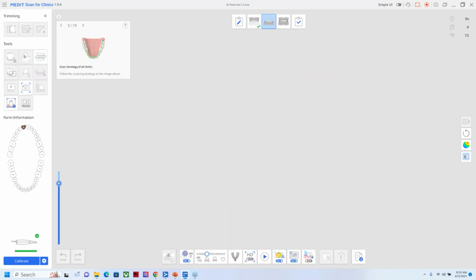We're going to do a quick demonstration here. You're going to watch as the new scan data is being obtained while I'm scanning. We're going to switch between basic scan technique, and now we're going to hop around a little bit more. So in the past, it was crucial to follow a smooth scan path without losing camera focus while collecting scan data. The skill level of the user or the person who's scanning and the patient's intraoral state could have a significant impact on the process. With Smart Stitching, it's no longer the case.